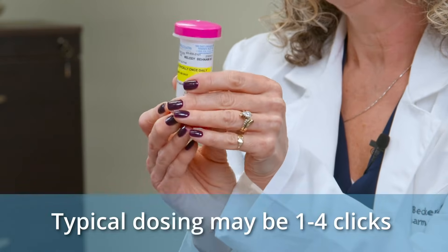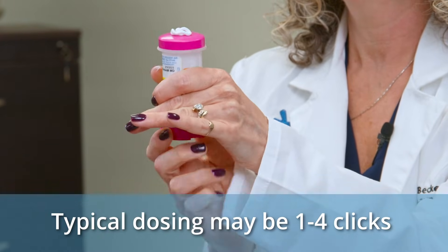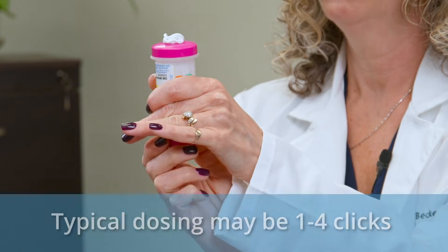You're going to use four clicks: one, two, three, four.